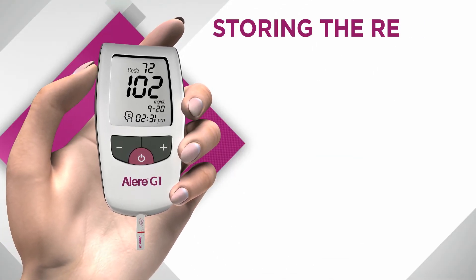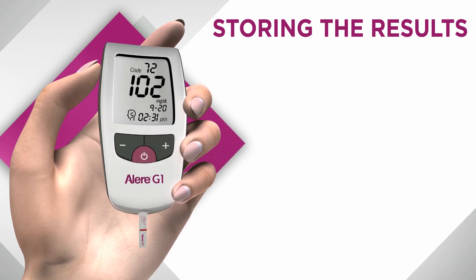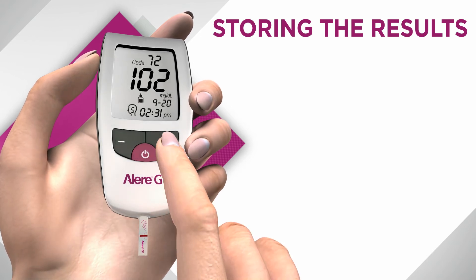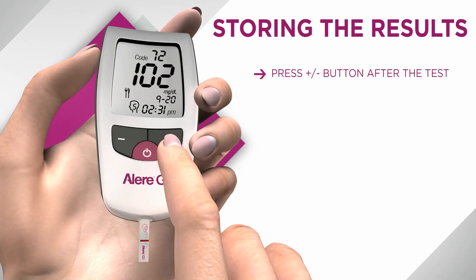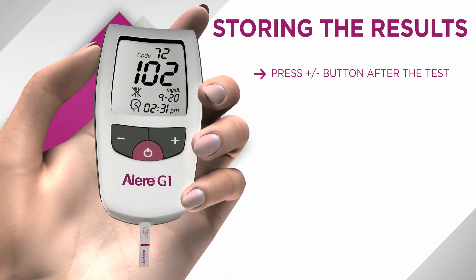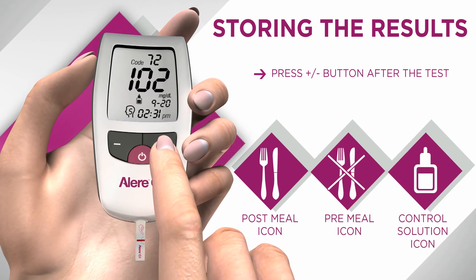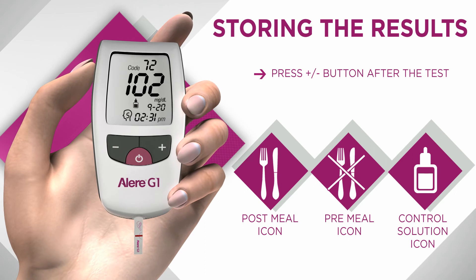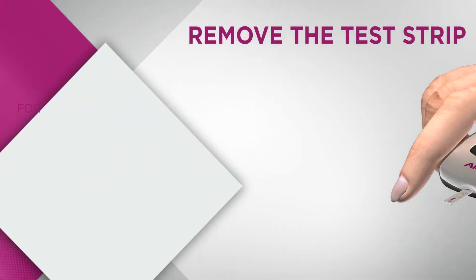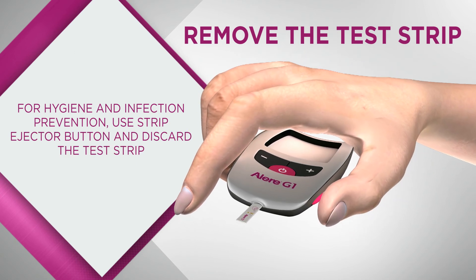Remember that storing your test result is as important as taking the test — it facilitates effective diabetes management. Once the test result appears on the monitor display, press any of the plus or minus buttons to enter the event record mode. There are three different event icons: post meal, pre meal, and control solution. Press the plus or minus button to select an icon which relates to the test result.